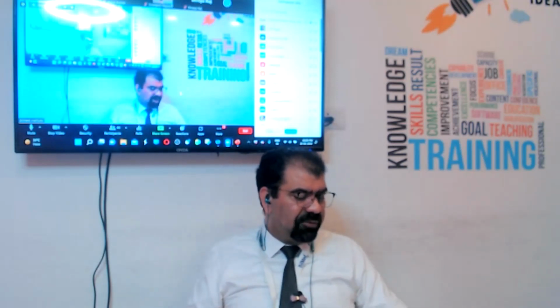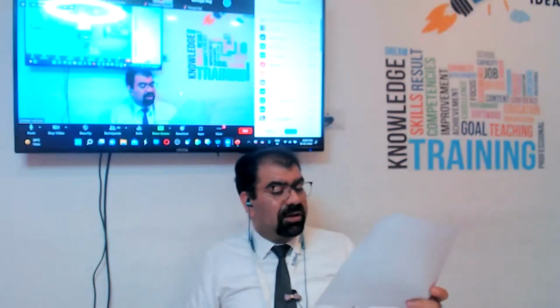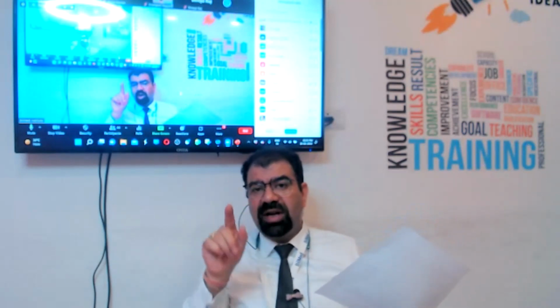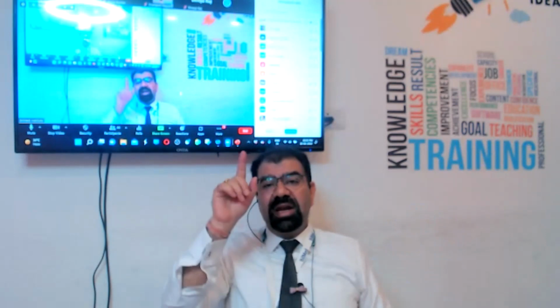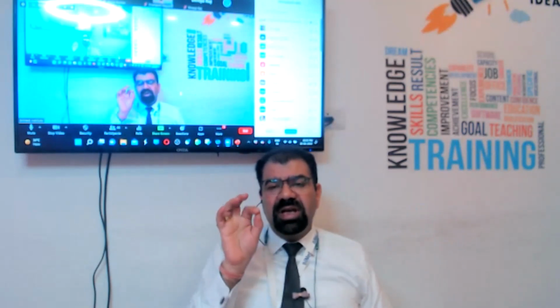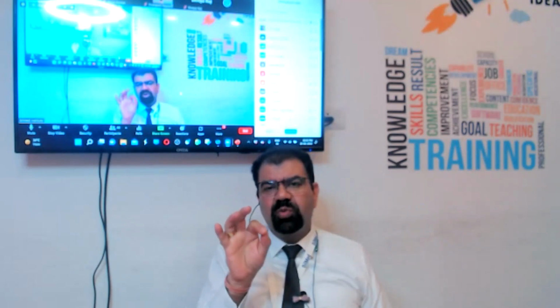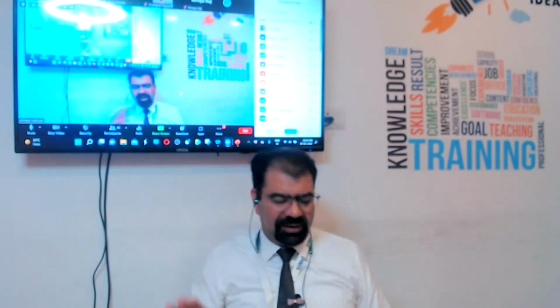So we are not taking ductus venosus in NT scan for hypoxia or acidosis, but for chromosomal abnormalities. But in the third trimester, the same ductus venosus is for fetal acidosis or hypoxia, which we will discuss in fetal color Doppler in great detail.